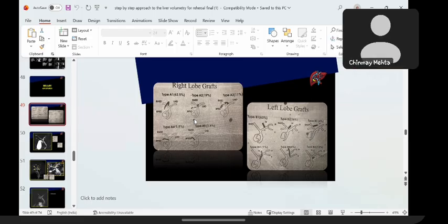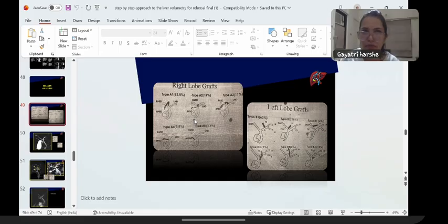Actually, the question was if segment 4 arises from the right hepatic duct. Okay, then, as I said, if segment 4 arises from the right hepatic duct, for a right lobe transplant they don't normally take it, because with the donor, this segment 4 will not be there, because that will come into the resection plane. That is the main thing.